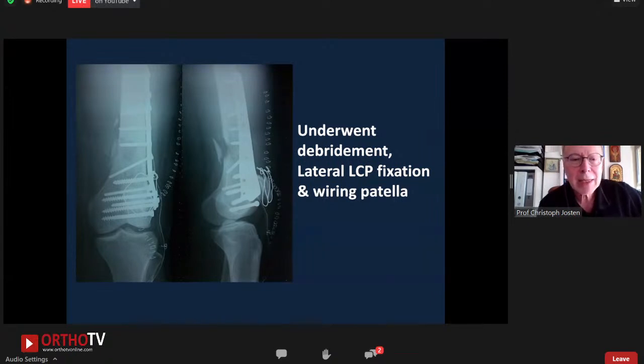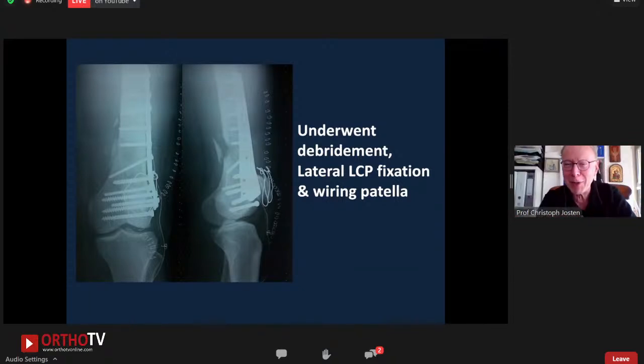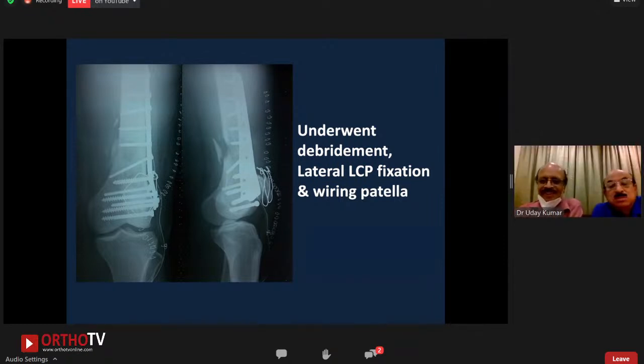So in this case, I would have used a more MIPO technique. That means not using a lag screw, making it a much longer plate, and not touching the fracture area, as Christian Krettek showed in his excellent first presentation on his ideas and philosophy concerning MIPO. That I would have done 10 years ago, and I would do also today. Any medial stabilization, sir? No, not any additional stabilization. I will talk about this later. Okay. Can I proceed? Yeah, proceed with that.